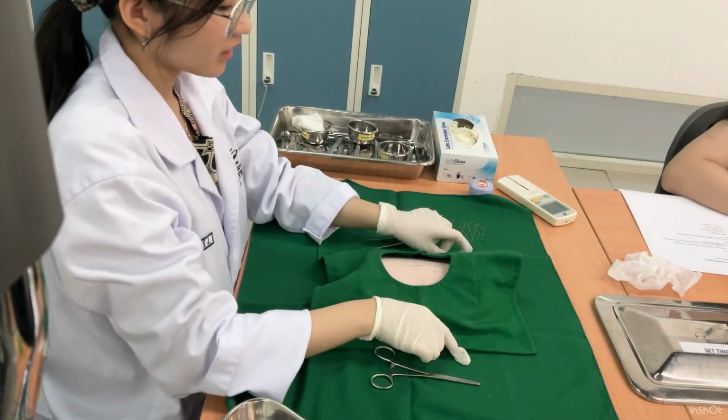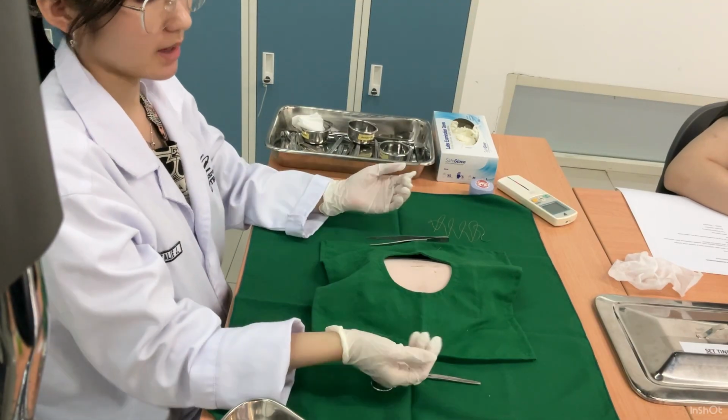Thank you. Okay, good morning. Today we'll be doing the vertical mattress suture. So the wound has been prepped and we'll begin with the procedure now.